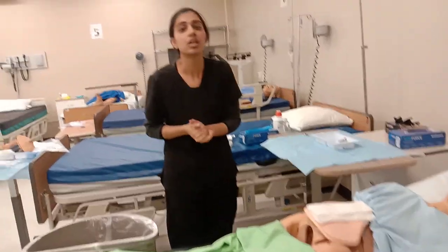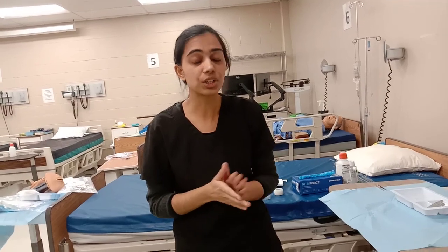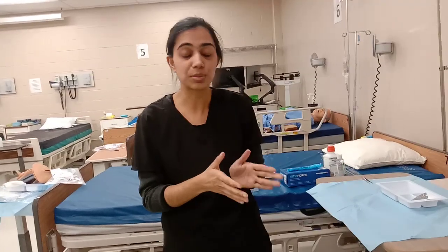Okay. So I have changed the dressing of the patient. I have cleaned the wound with betadine solution, and the patient tolerated the procedure very well. The findings that I am going to document in the EMR are: the length of the wound is 13 centimeters. The location of the wound is at the abdomen, at the midline, above the umbilicus. The edges are well defined, and the wound is approximated appropriately. The wound has been closed with the sutures.